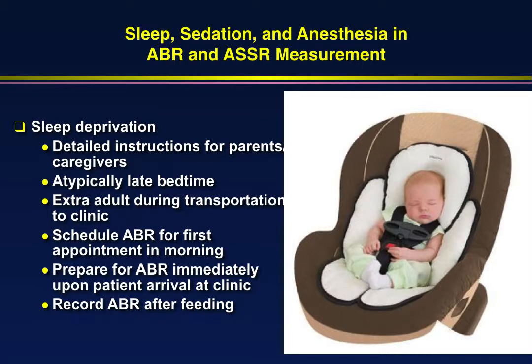The moment they show up at the clinic at 8 or 8:30 in the morning, I immediately am standing in the waiting room. I scrub their skin on the forehead for the non-inverting and ground electrode. I scrub their earlobes immediately, and I take them right back to the ABR room. I put the disposable ear electrodes onto their skin, and then I let them fall asleep.